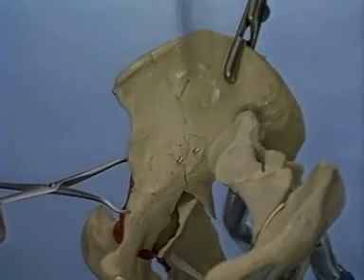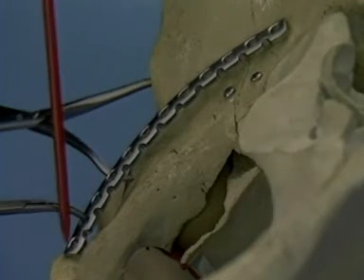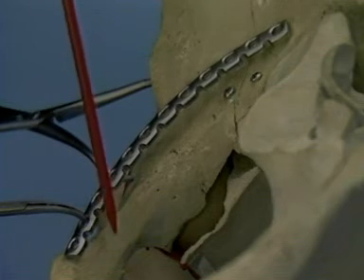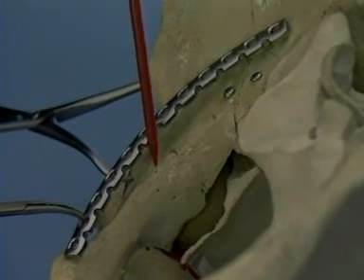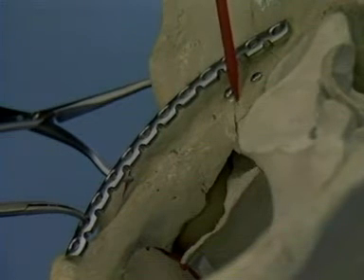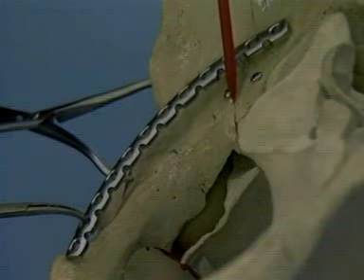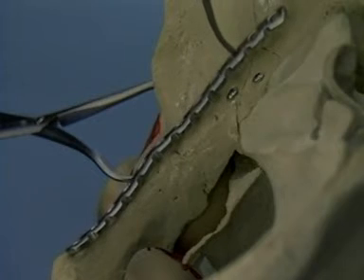A 12-hole plate is seen to be the correct length for the fixation from the internal iliac fossa to the superior pubic ramus. It may be necessary to adjust the curve of the plate to match the individual pelvis. The plate is concave over the superior pubic ramus, convex over the pectineal eminence, and then again bent in a concave fashion over the internal iliac fossa. The fully contoured plate is now seen as it will lie along the pelvic brim.